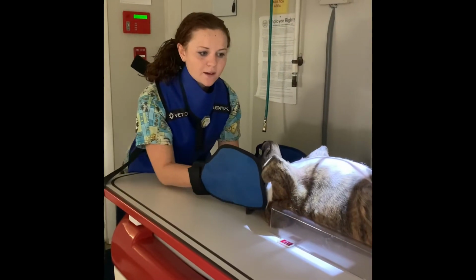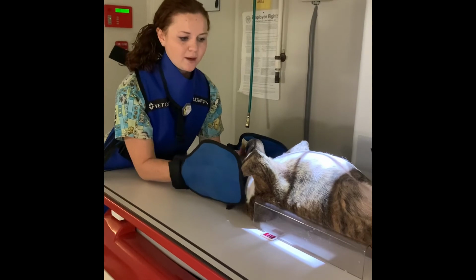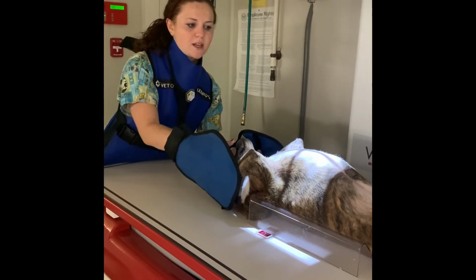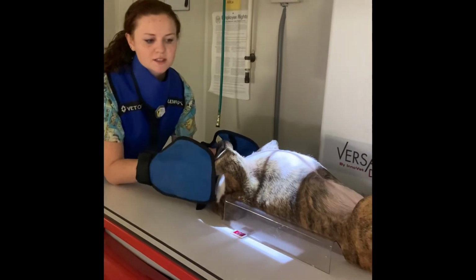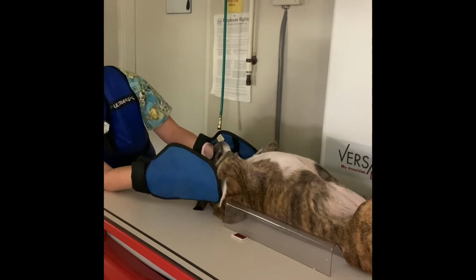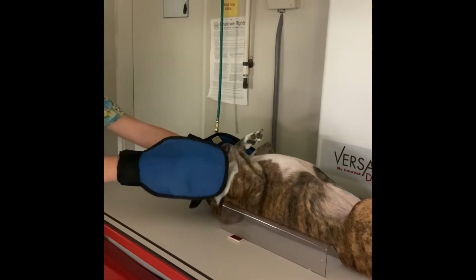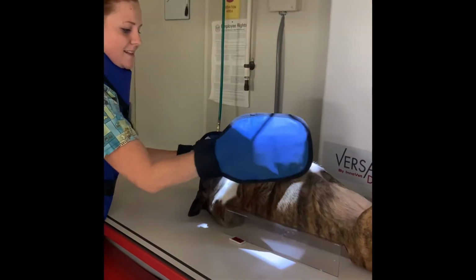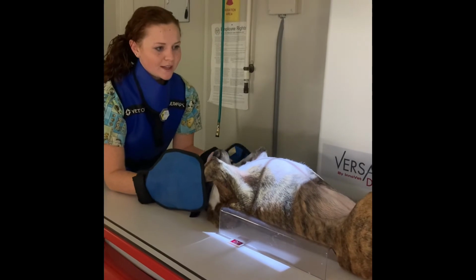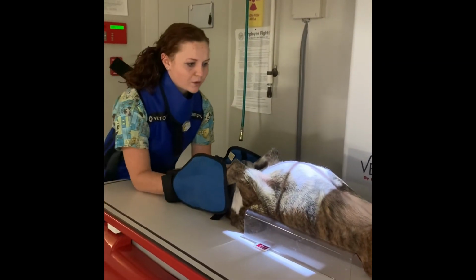Okay, so now that we have her in the trough, we moved it back just a little bit so that way it's just below the point of her shoulders, and then the crosshairs is going to be on either side of the scapula end there. My R is on the side there. A little bit crooked, so we'll straighten her back out. My assistant's just going to pull her hind legs back while I pull her front back.